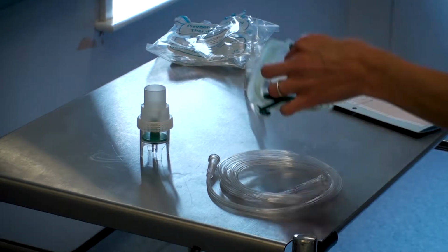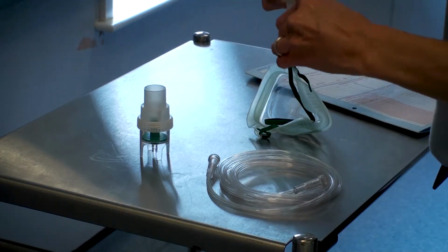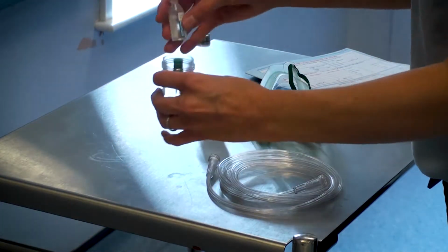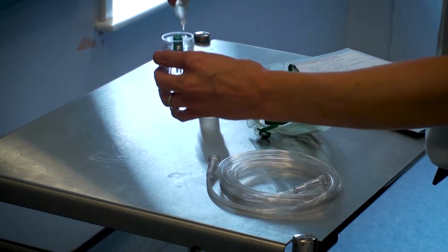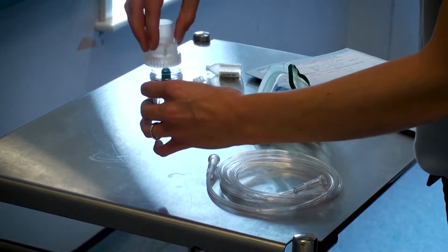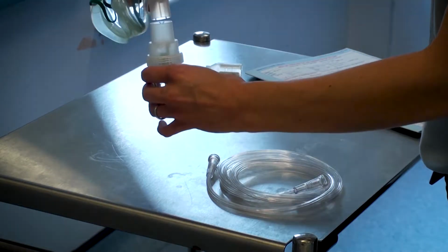You'll now have a mask or mouthpiece, nebulizer chamber, and oxygen tubing. Unseal the solution container and the nebulizer reservoir and fully empty the solution that you are administering to the patient into the nebulizer chamber. Put the lid back on and then attach the mask to the nebulizer chamber.